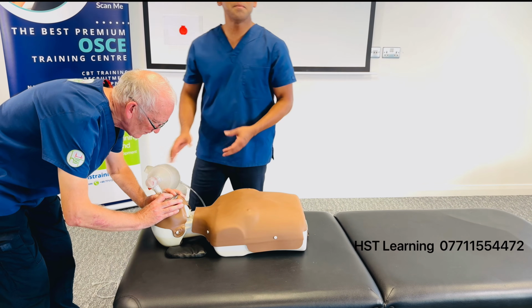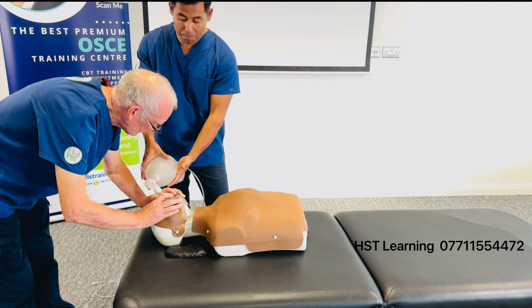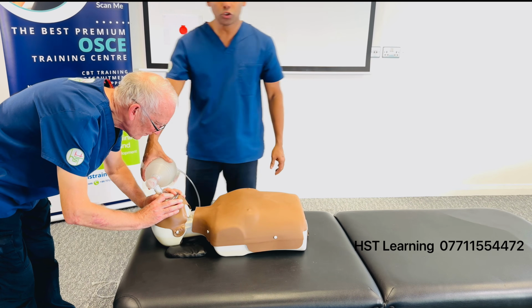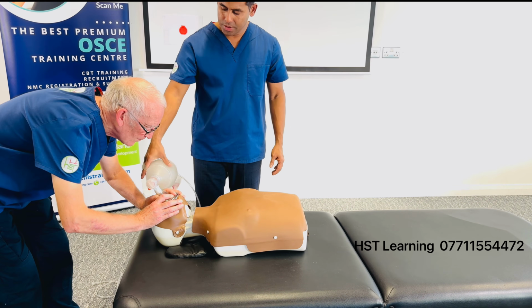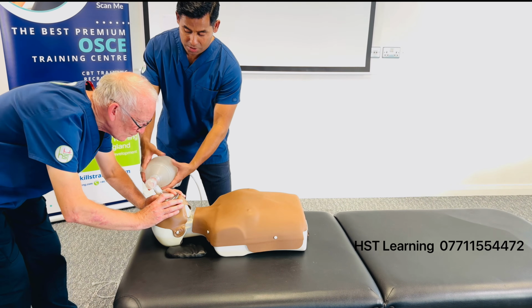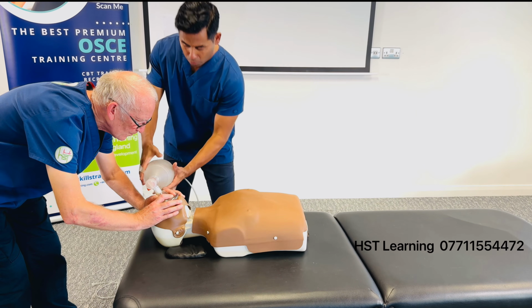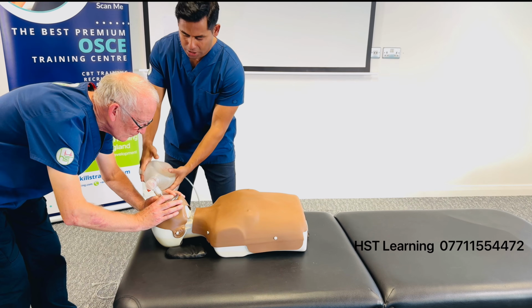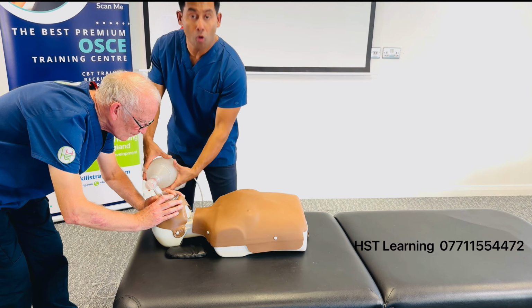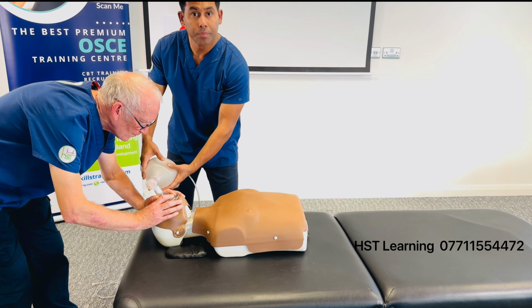Now the compressing method. How do you give ventilation? It's the best way to compress. You can put the hand there with the grip, and you can use one hand, or you can use 2 hands. Have a look. I only press with the thumbs there, hold it rounded, and press half of the bag. Try not to press the whole bag, that is too much, and go as you breathe normally. Don't go faster like this. 1, 2. So you should be going 1, 2.